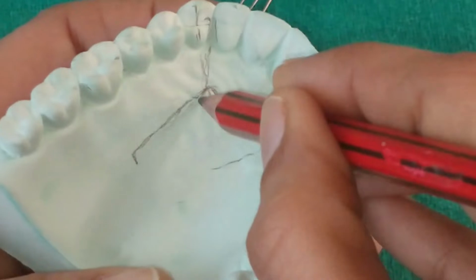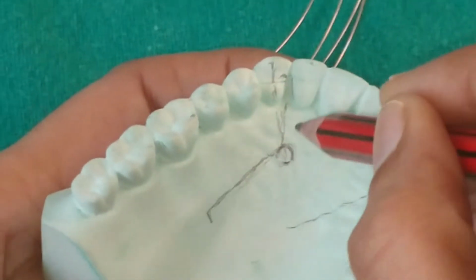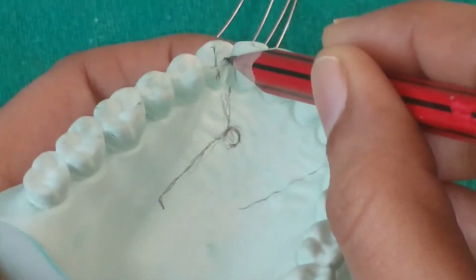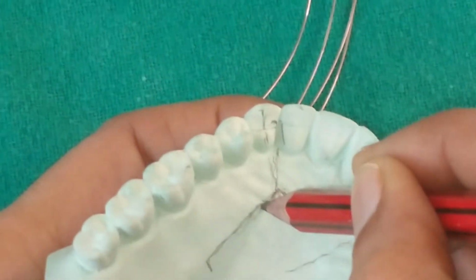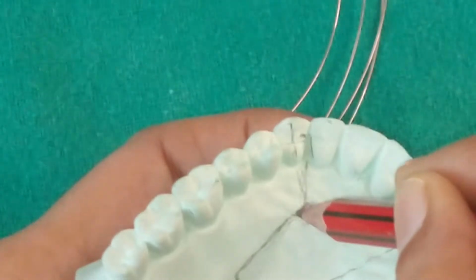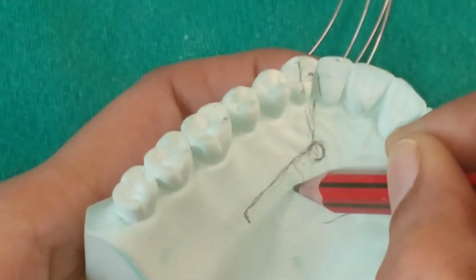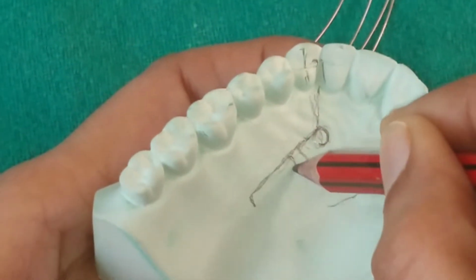It consists of a helix in the axis of the canine and consists of a mesial arm, which is an active arm, and the other arm is the retentive arm, which gets embedded in the acrylic. It also contains a loop for activation and adjustment.